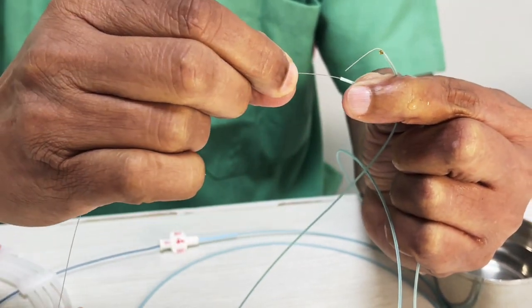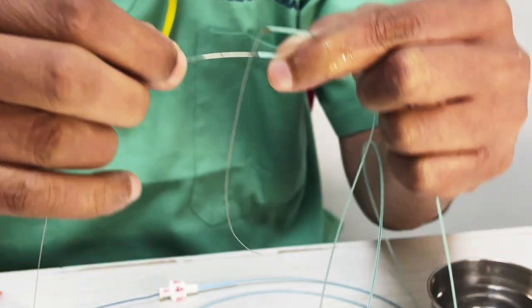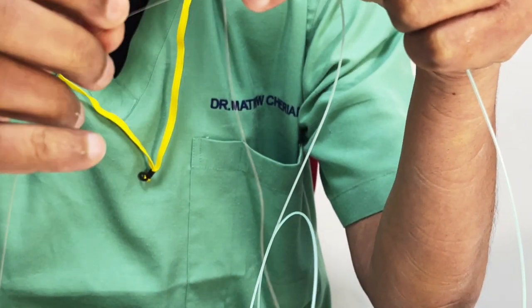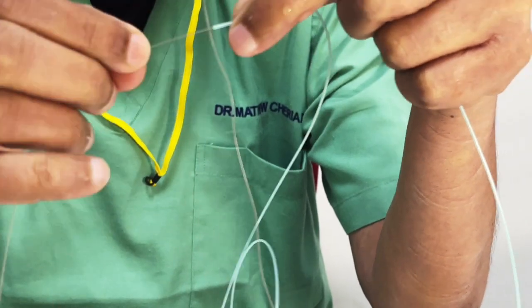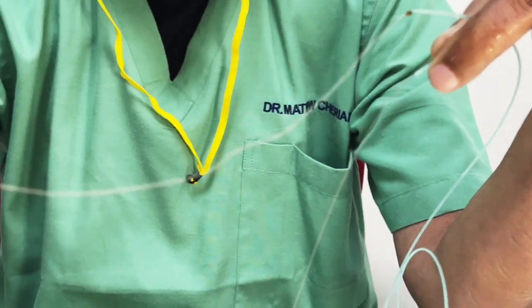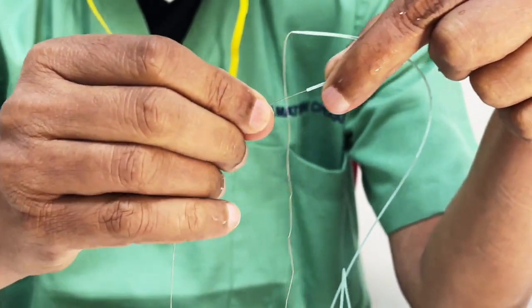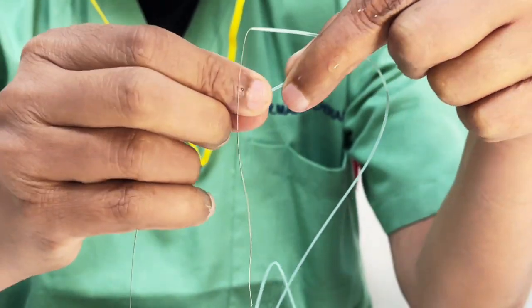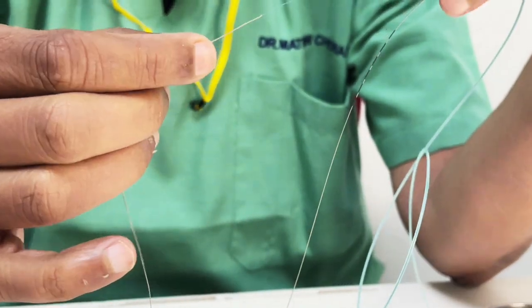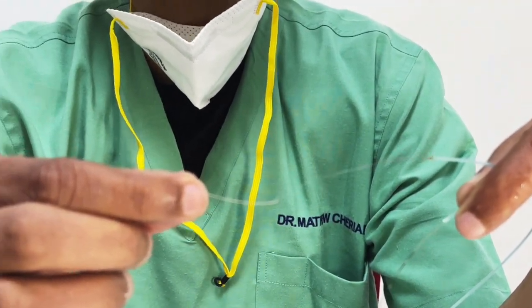So here is a coil. Now, what was the size of the coil? I'm not sure. It doesn't look like a coil. It's a very large diameter coil. It has completely lost character. So forget the size for the time being, because this is a coil that has got stretched. It has no character at all in it. This happens because it's reused and we have used it several times, but I want to show you some characteristics of the coil. This is a very long coil, and this is the junction. Can you see? I told you it's stretched. The character of the coil completely goes once it is stretched.